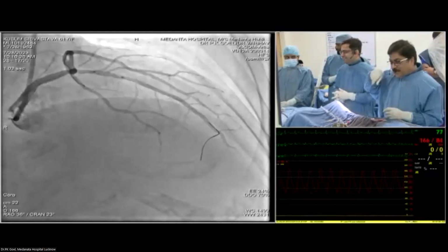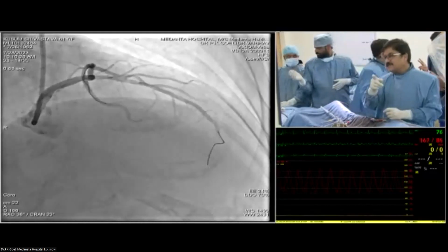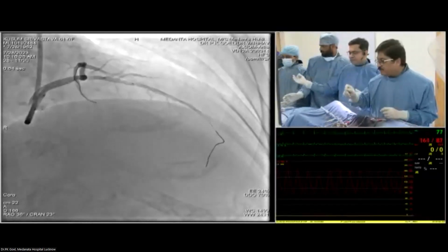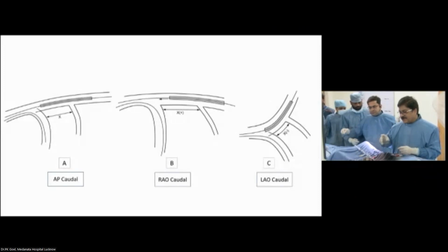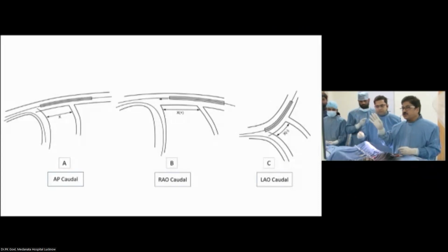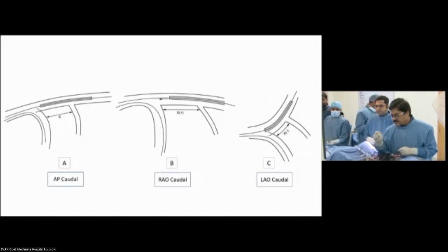I wanted to show you that. But because my case turned out to be with some left main disease, if I can see a slide, I do very often pure ostial stent. Can I have a slide, please? The next slide. This is a little away from this case, just understand this. If the left main, I hope you're seeing this slide. If the left main would not have had the lesion, and I had true ostial, as I showed you on the spider, it looked ostial only, but we know that this patient had left main distal and some disease.